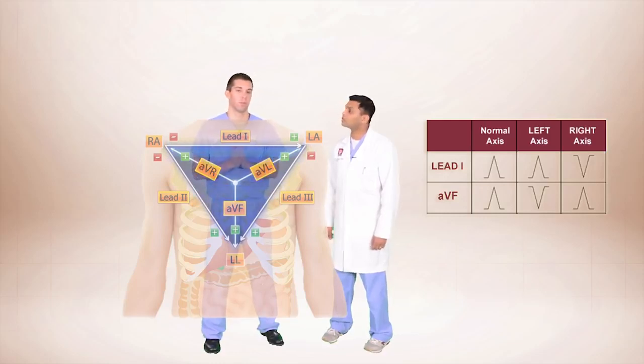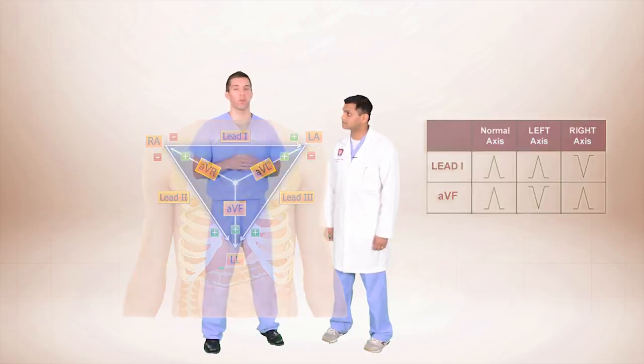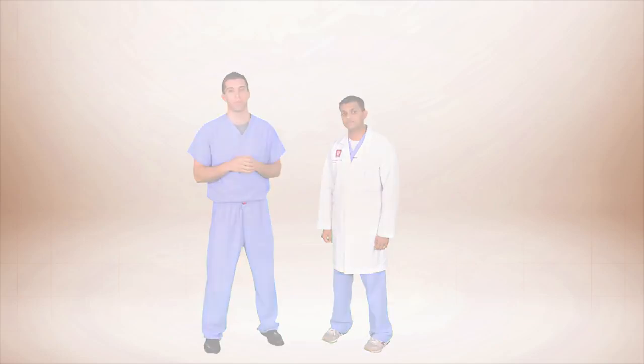That's pretty good. What about if it's positive in lead 1 and negative in AVF? Well, that would mean that our axis is somewhere in this quadrant, and we would call that left axis deviation. Exactly right. So now that we have a better understanding of how to determine axis, let's practice on a couple 12-lead EKGs.